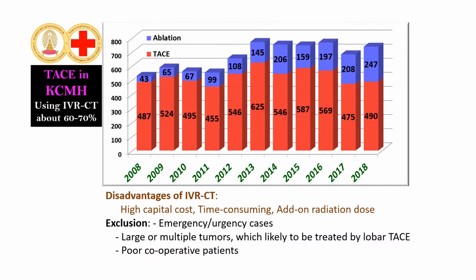We have around 500 cases of TACE a year. Due to resource limitation, we cannot use IVR-CT for every case. For a case that's quite simple and straightforward, such as a large tumor or multiple tumors, we will use conventional DSA. IVR-CT is also not suitable in an emergency setting and in a patient who cannot cooperate.